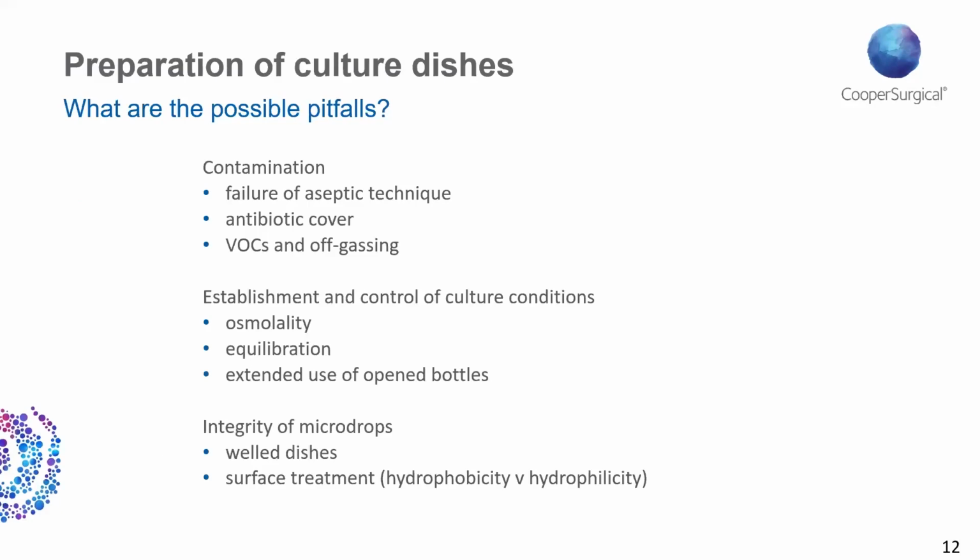We used large box incubators that had trays of water in the bottom of them. We suffered horribly with contamination. The environment wasn't great. Our techniques potentially weren't great, and we didn't have any safeguard with the oil layer that we use nowadays. So contamination was always a big issue.